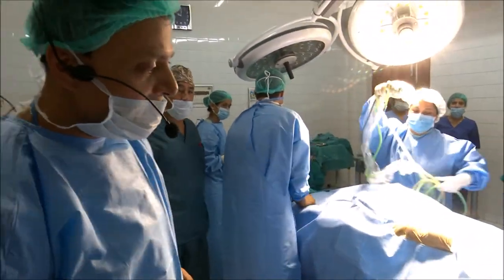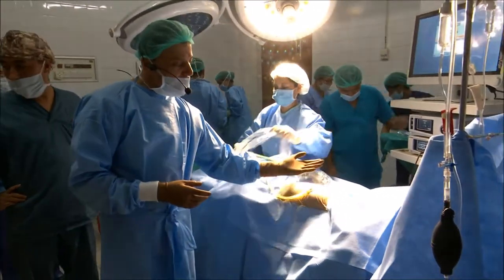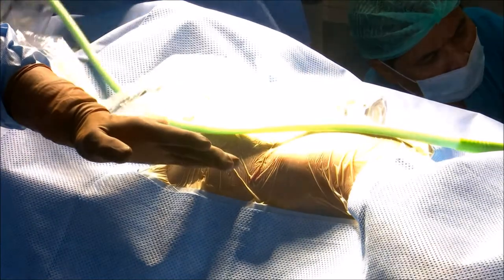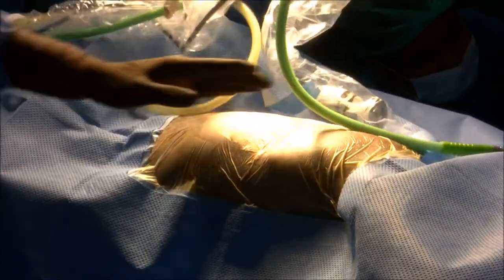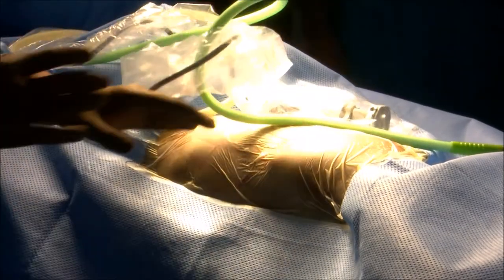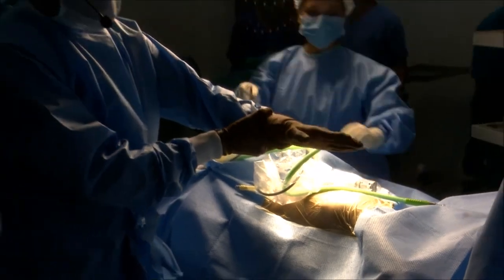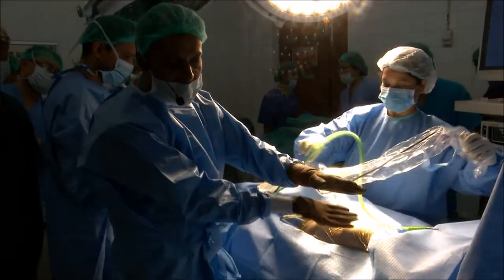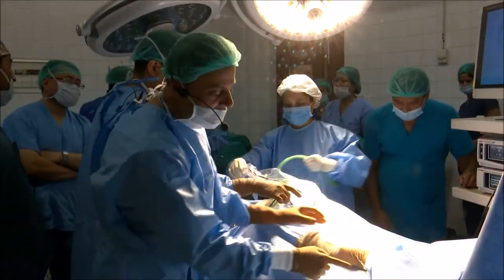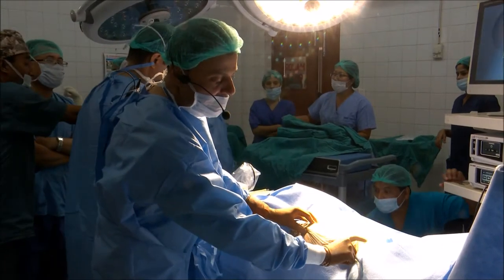So thank you very much. Regarding this patient, it has been already mentioned — the patient has been put in the lateral position and tilted completely. We made the condition semi-prone. Actually, this is not the prone position totally. We operate in the semi-prone position. So the patient was in the lateral position, then we tilted the bed, so it is about a 45-degree angle from the posterior line. You can see this is the scapula — tip of the scapula — with the marking line.